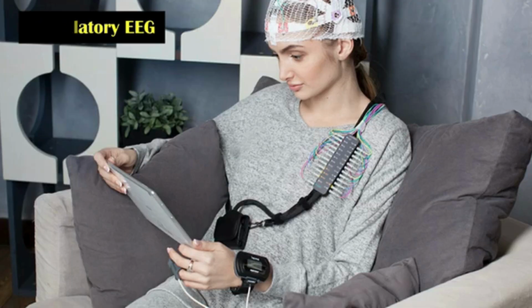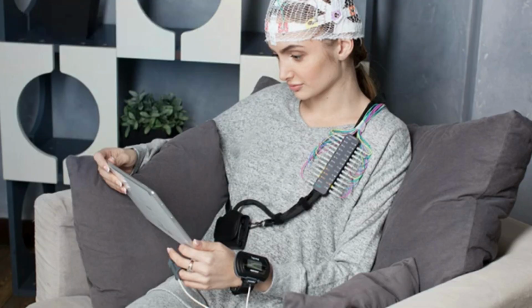An ambulatory EEG is where brain activity is recorded throughout the day and night over a period of 1 or more days. The electrodes are attached to a small portable EEG recorder. Patients can continue their normal daily activities during this test.